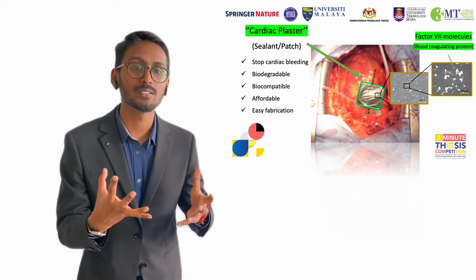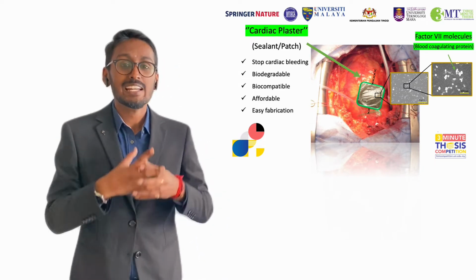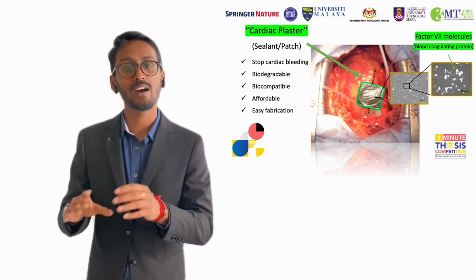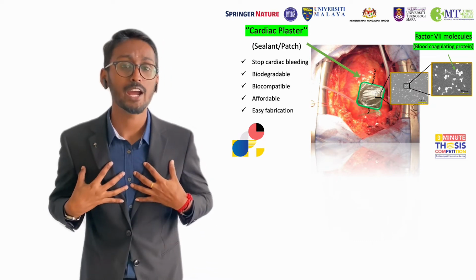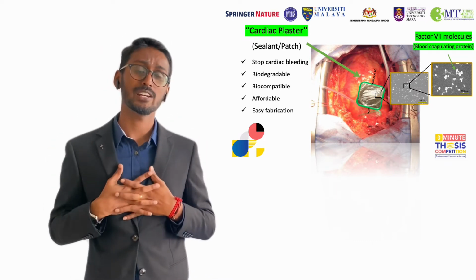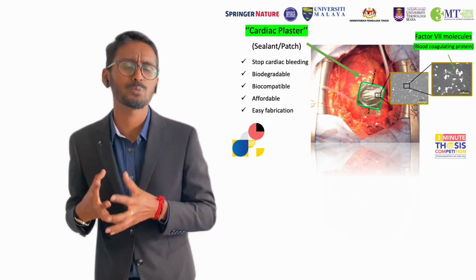The bleeding happens, well, not because of heartbreak obviously, but because of the leaking of blood from the suture region during the closure of the cut after the surgery. It's shocking, and as a Malaysian, I don't think we need this kind of buy one free one offer in such a life-threatening situation. But unfortunately, it happens unexpectedly.